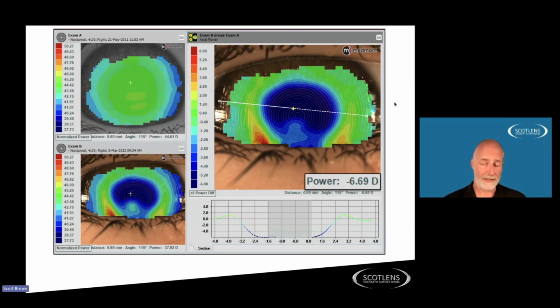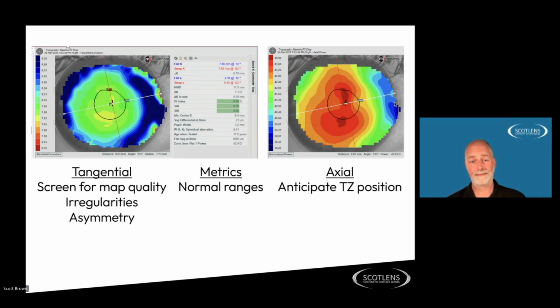Now, of course, I should say that this is all because the nocturnal lenses, which are the best ortho-K lenses in the world, give this kind of correction for patients. But with this patient that's minus 6.5, you might get another patient that's minus 6.5 and you don't get a good correction, or they get an induced astigmatism. It's because the baseline cornea is not as good. So this baseline assessment is useful.